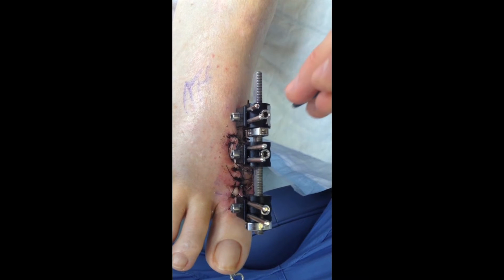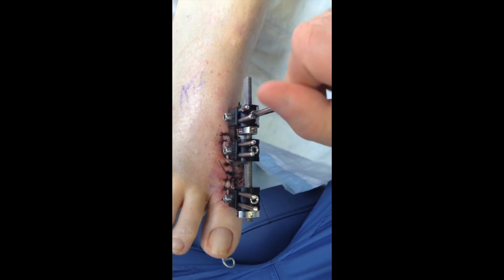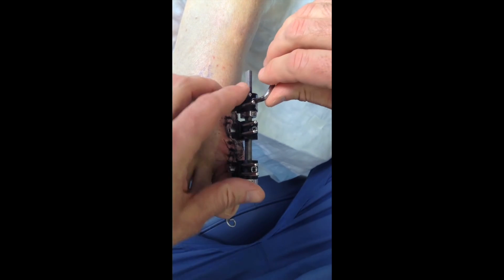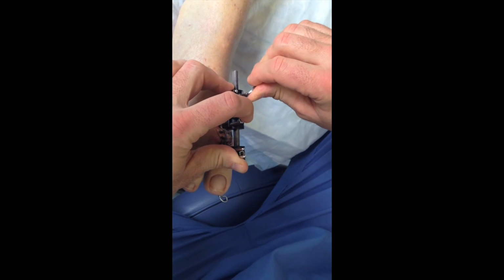And then we go back and lock this up. Okay. It has to be pretty snug. You can hold these pins just like that. Okay. I think you can see that this adjustment to the mini rail is quite simple, and it's something that any patient could do easily at home.